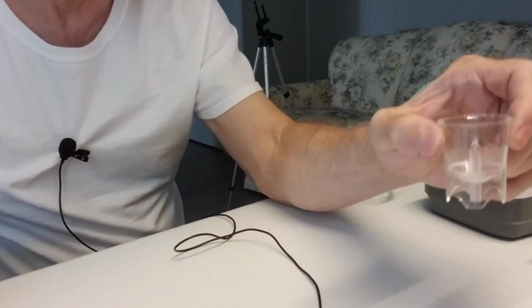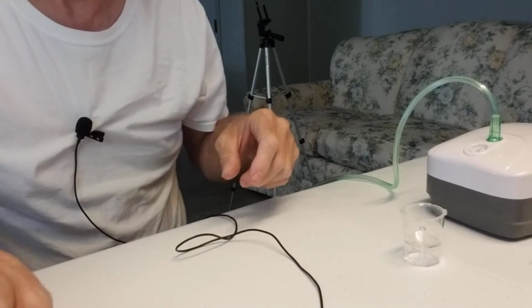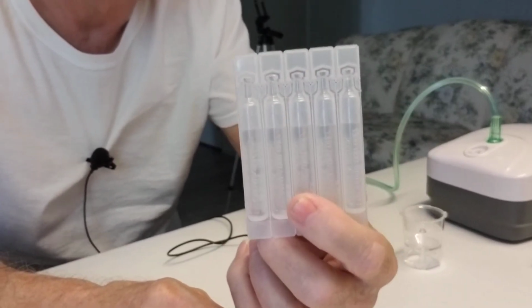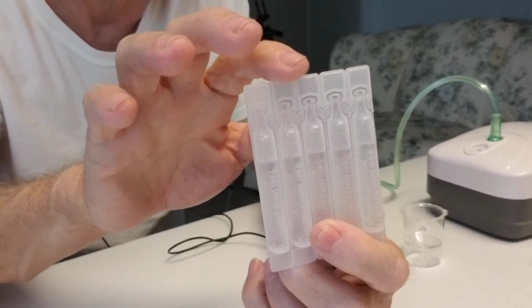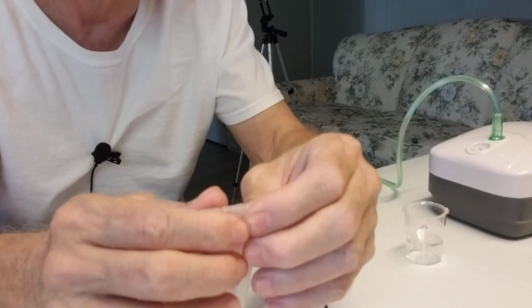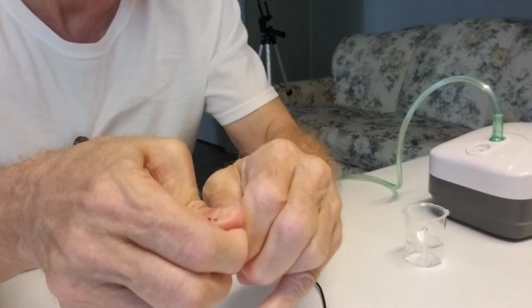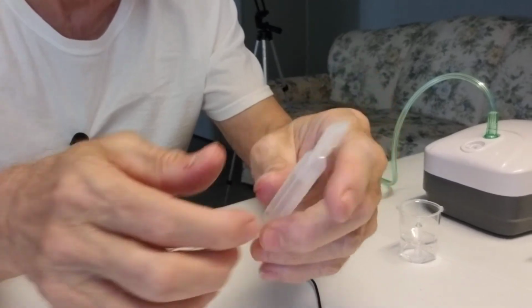This is your main cup in which your medication goes into. Okay? What you're going to get from your physician and your pharmacy are packets that will resemble this. Each one of these is an individual dose of medication taken however many times prescribed per day by your physician. You're going to get these. They just simply pop apart. Sometimes tougher than others. Simply pop those apart.